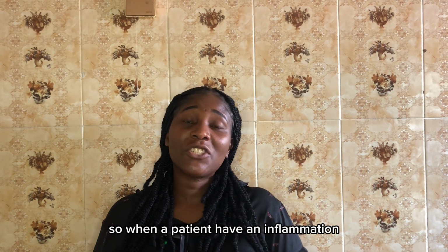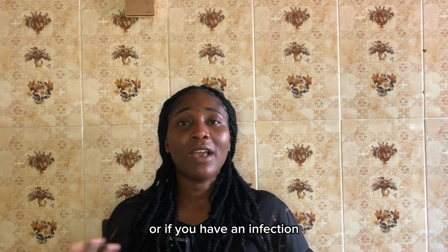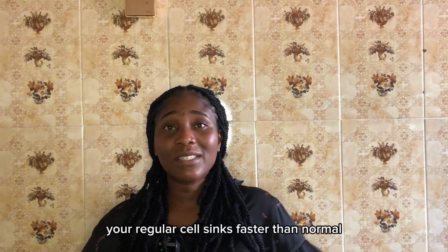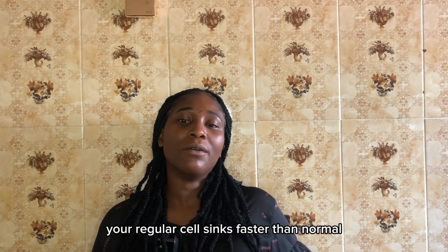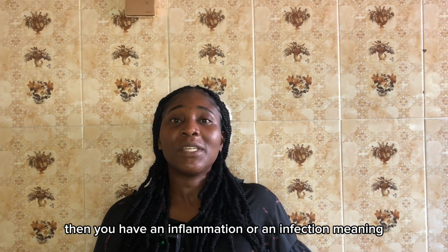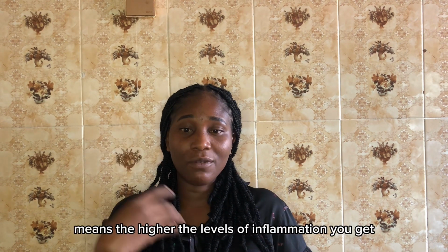So if a patient has an inflammation or an infection, and your red blood cells sink faster than normal, then you have an inflammation or an infection. The faster your ESR rate, the higher the level of inflammation.